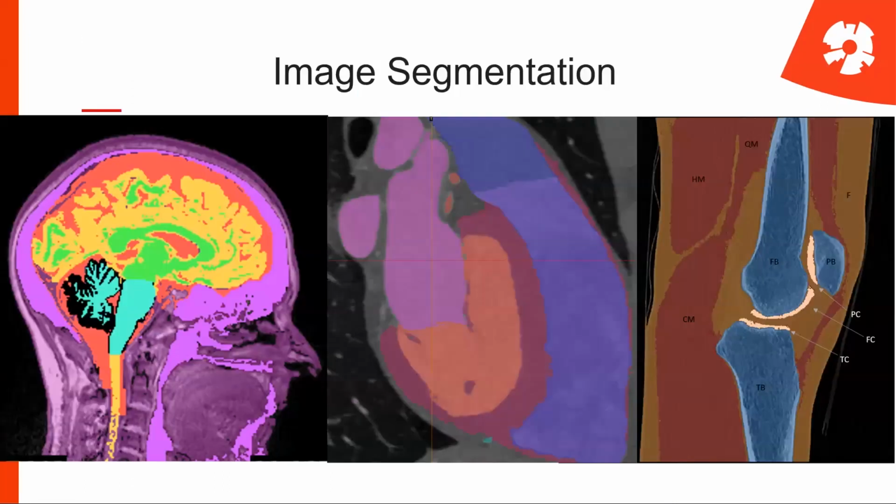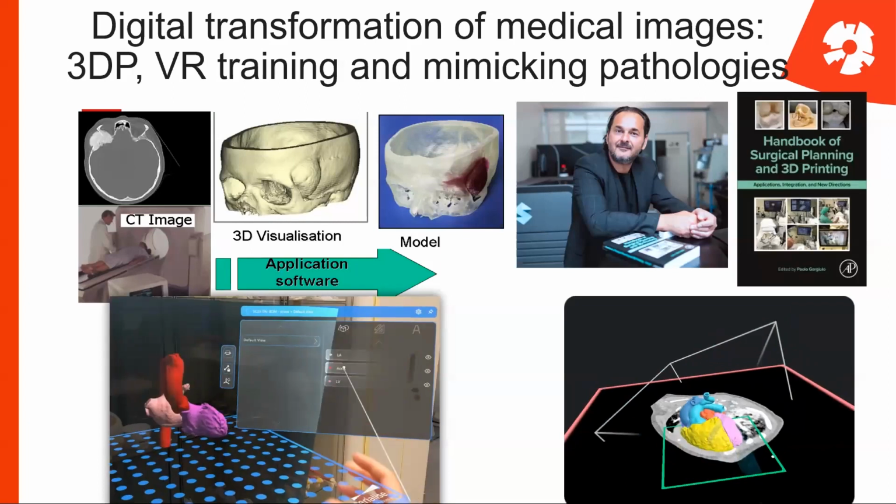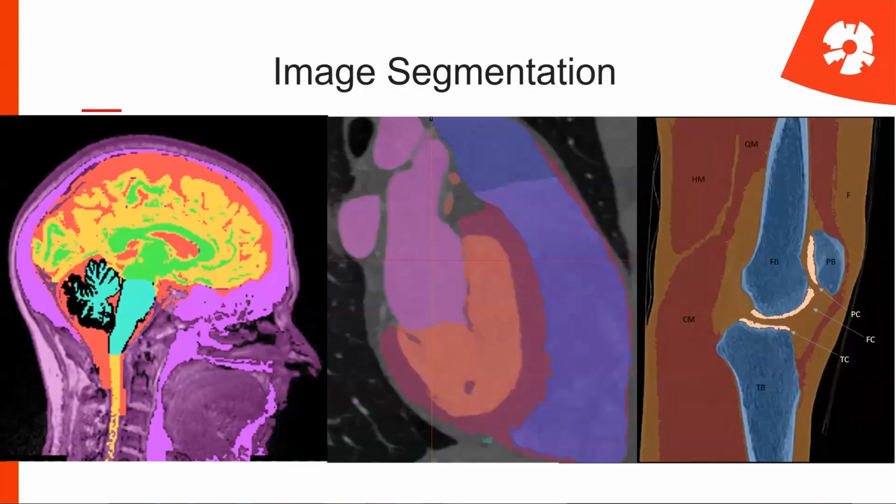The obvious transformation that is used by many for segmenting human parts is to code that information in the pixels to label different regions of interest inside the body. With MRI, we will be more successful in looking at soft tissue, while with CT we have bones that are practically well defined by the gray values, or by the Hounsfield value.